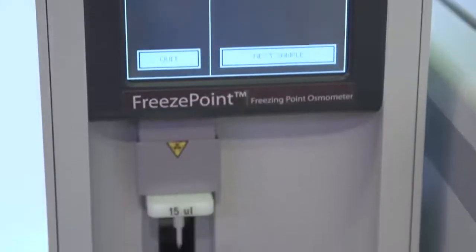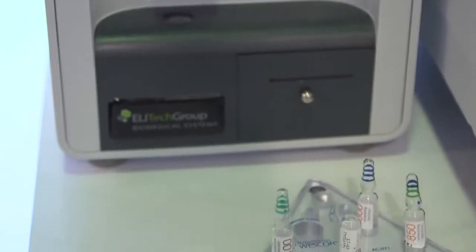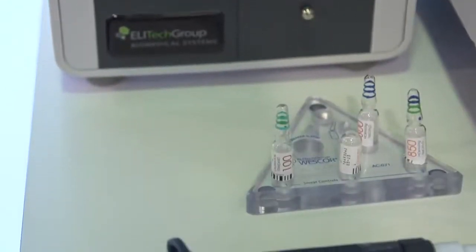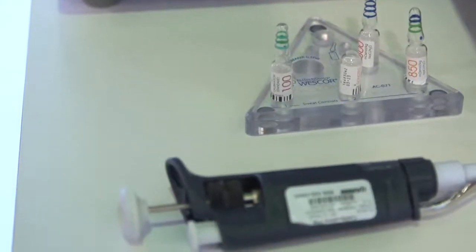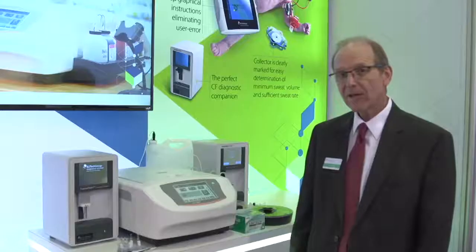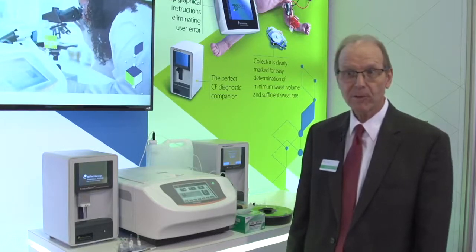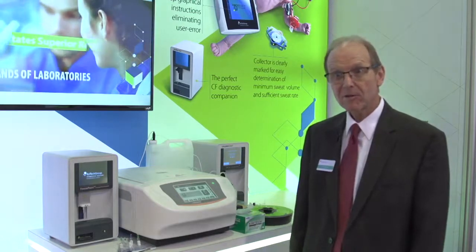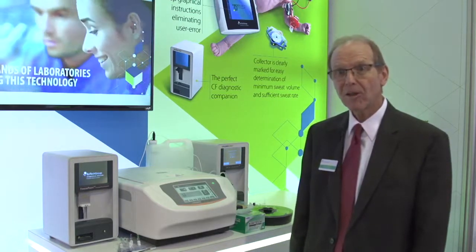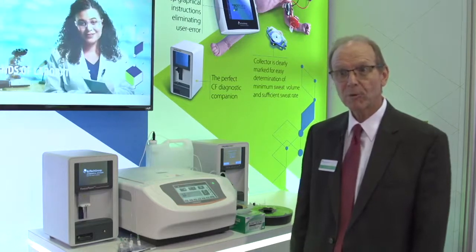The freeze point osmometer is used to measure solution concentration. You can do that in a couple of different ways. You can look at the vapor pressure depression, which we have a vapor pressure osmometer to do — that's used a lot in research, pharmaceutical, drug development. Or you can measure the freezing point depression of a sample, and that's used a lot in a clinical laboratory, which is what we're focusing on with the freeze point osmometer.